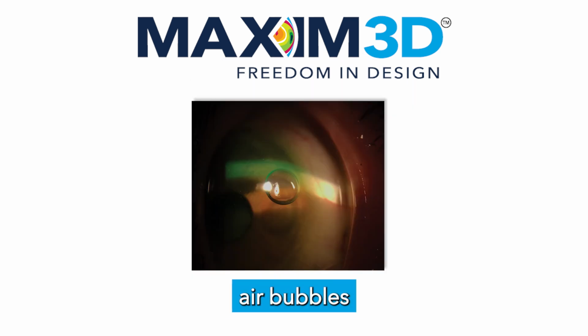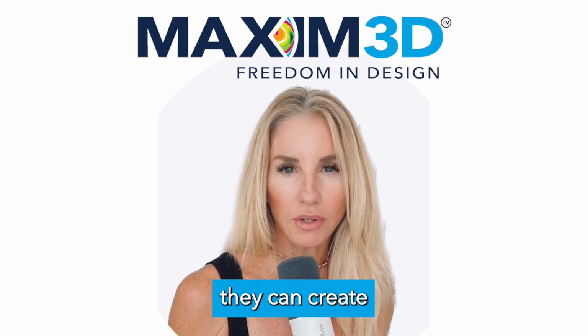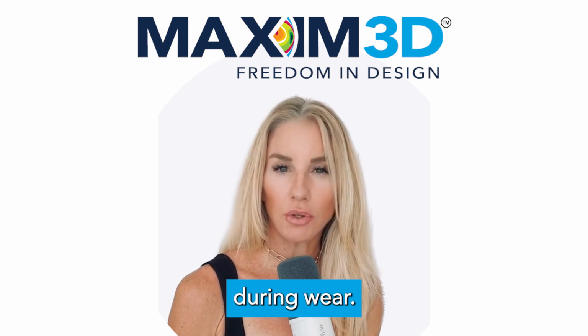Central or peripheral air bubbles under the lens are usually bubbles that remain stationary. They don't shift with blink. They can create localized blur and dryness during wear.